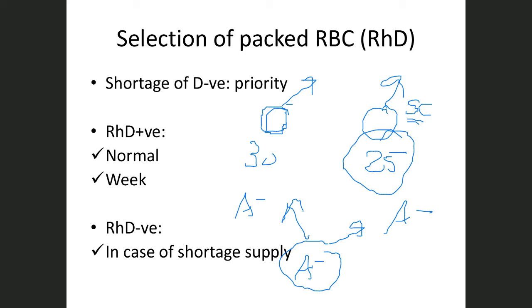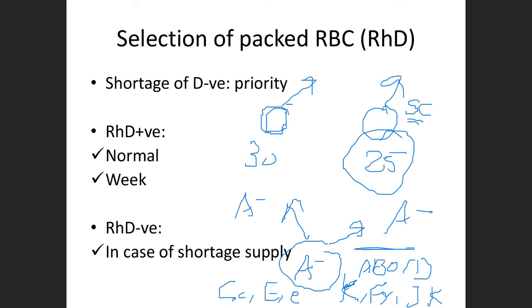So in this type of patient, we not only do ABO and D typing, but we also do extended phenotyping. So we are also looking for Kell, the big K. We start matching other antigens: we try to match the K, the Duffy, the Kidd, and other principal antigens from Rh, C and E. We try as much as we can to provide them with compatible blood. We don't want to sensitize them, as we will see today, inshallah.